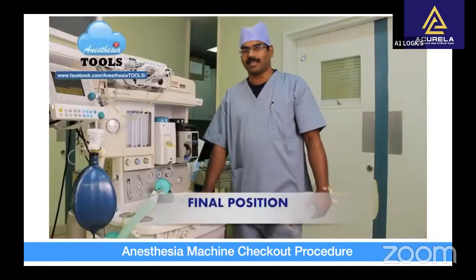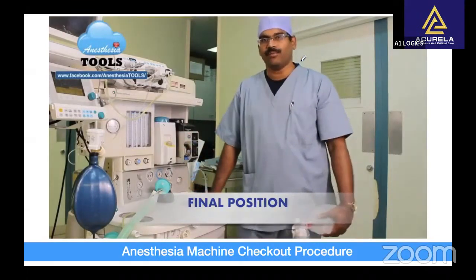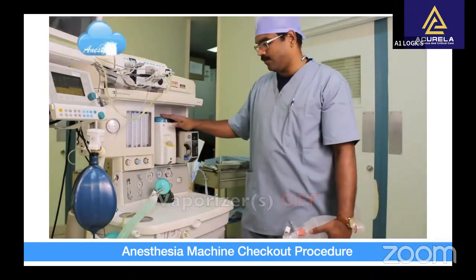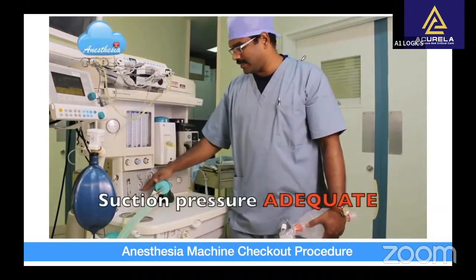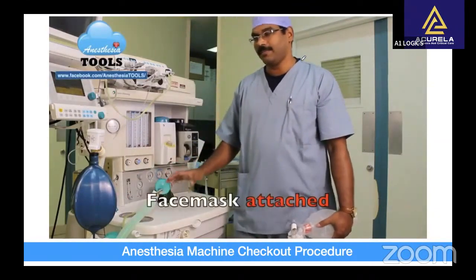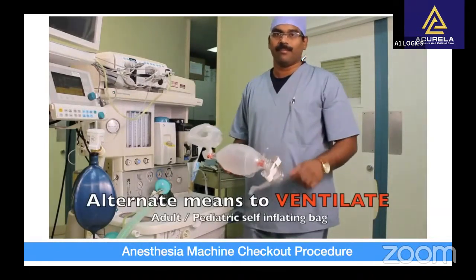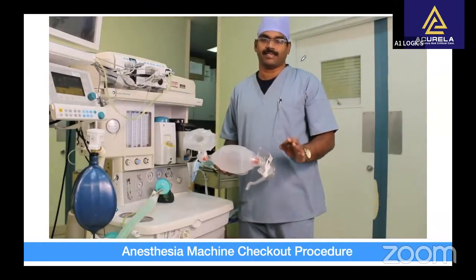The machine checkout is complete when you make sure we have the final position and are ready to go for the first case. Make sure that all the flow meters are off, your vaporizers are off, APL valve is fully open. Make sure adequate suction, appropriate breathing circuit and mask is attached, and you have an alternate means of manual ventilation with an independent source of oxygen in case of any equipment failure. You are ready for the first case.